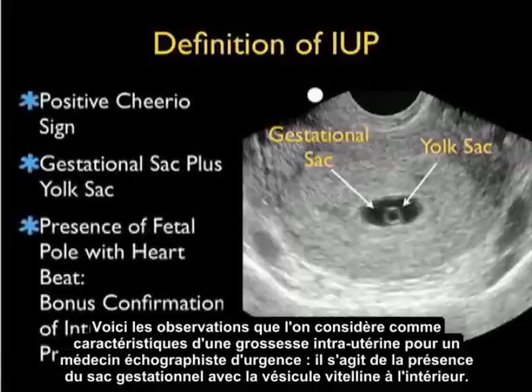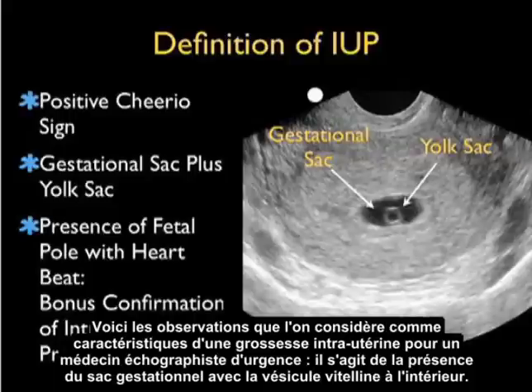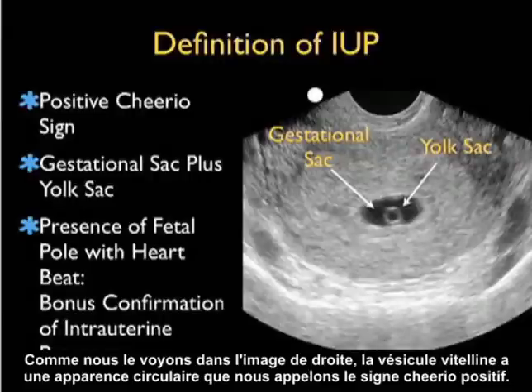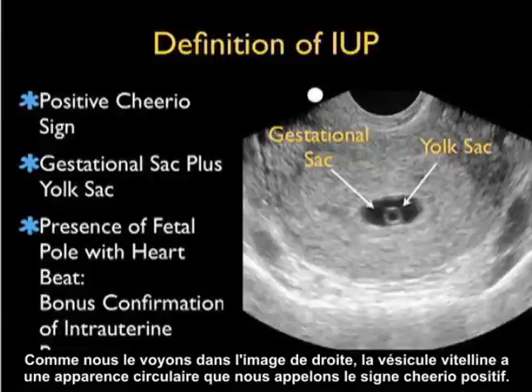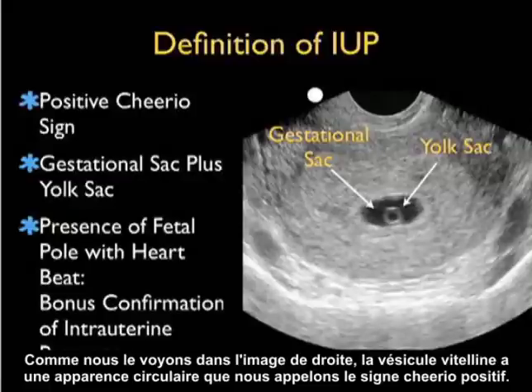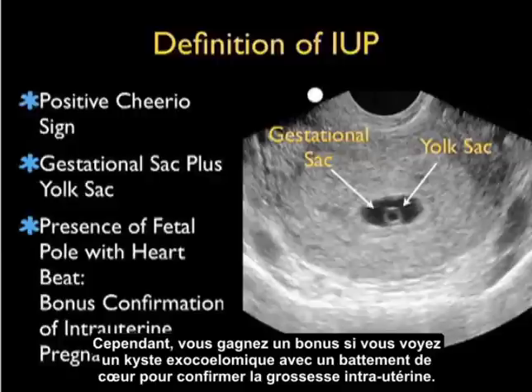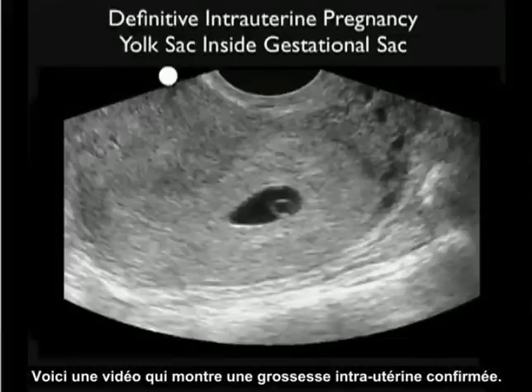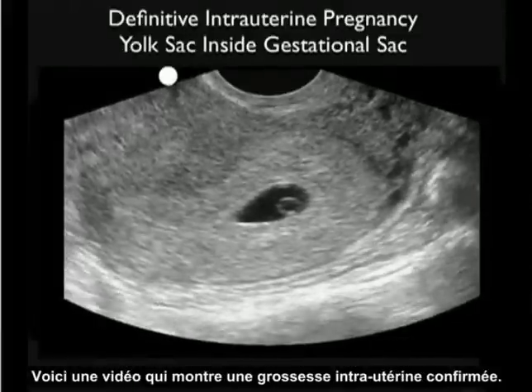The findings that define an intrauterine pregnancy for an emergency physician sonographer are the presence of a gestational sac with a yolk sac inside. As seen in the picture, the yolk sac has a circular appearance that we call the positive cheerio sign. Remember: gestational sac plus yolk sac is indicative of intrauterine pregnancy. Bonus points are given if you also see a fetal pole with a heartbeat for confirmation. Here's a video clip showing a definitive intrauterine pregnancy.